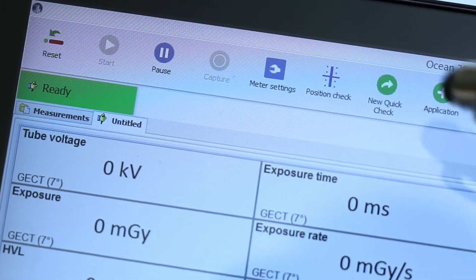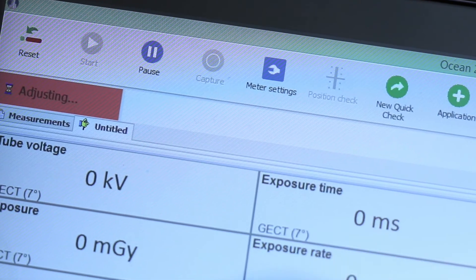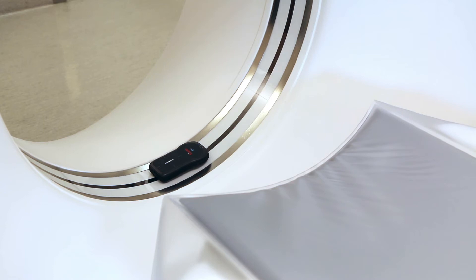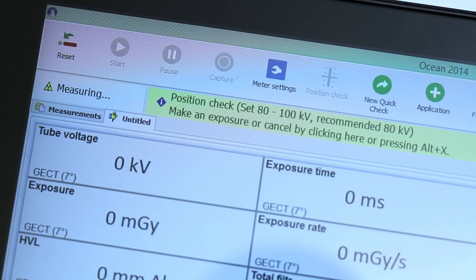First, we recommend that you do a position check to be sure that you are in the fan beam and that the lasers are correctly positioned. To do this, just make a short topogram scout with the tube at 12 o'clock and get the position confirmed by Ocean.